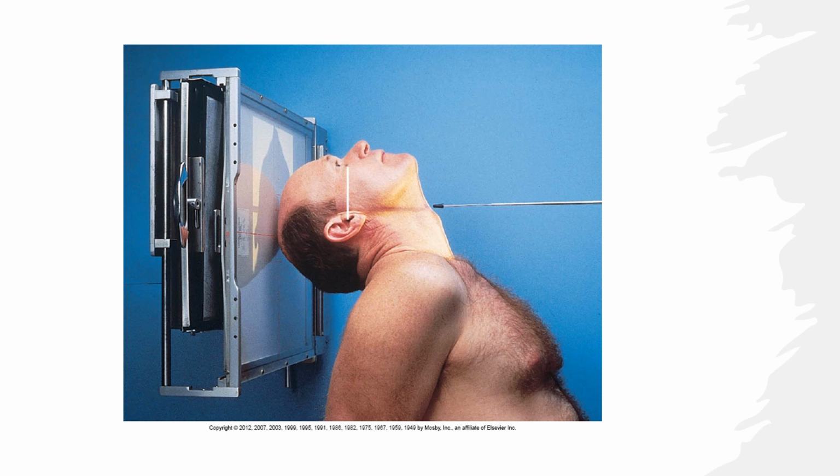So if the patient is leaning their head slightly forward from this, then you're going to need to angle upwards, that is angle superior or toward the patient's head, cephalad, to maintain a 90-degree relationship between the patient's IOML and the central ray.